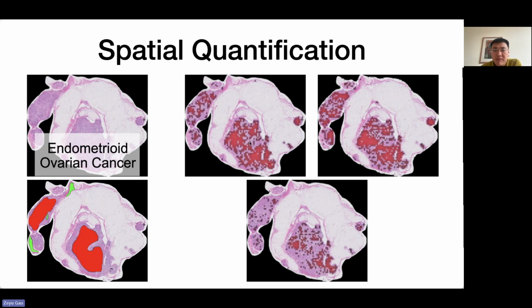And some of them do give you better quantification or spatial assessment, but still have a lot of misdetection error. Qualitatively it makes sense. You focus on several important regions, and you make your decision. But still, this result cannot be used to tell you how many tumors this patient has involved, or the proportion of different subtype regions, right?